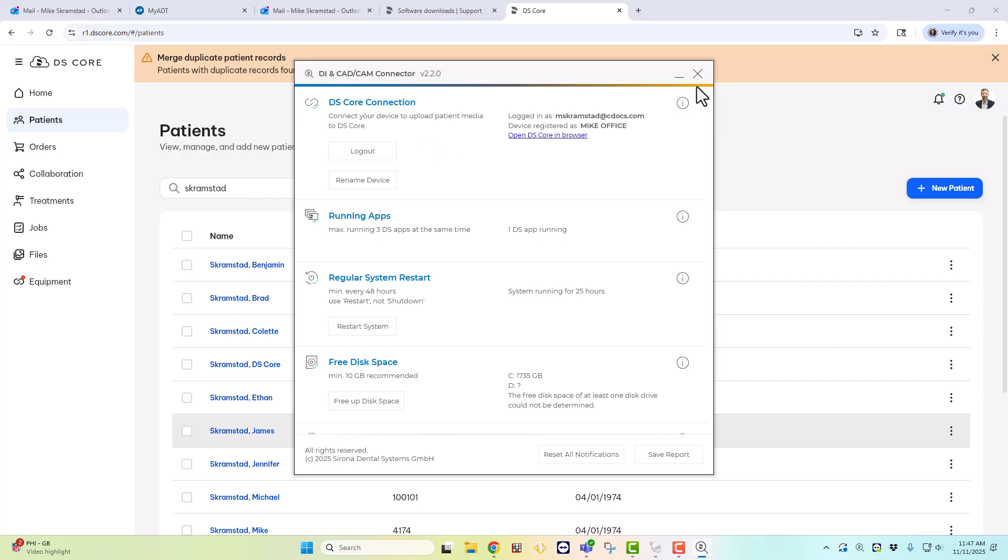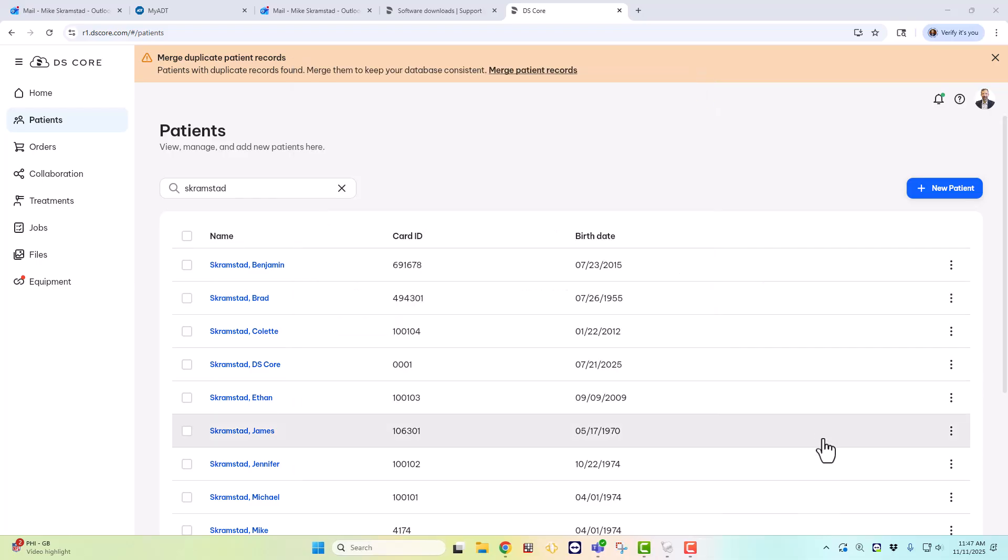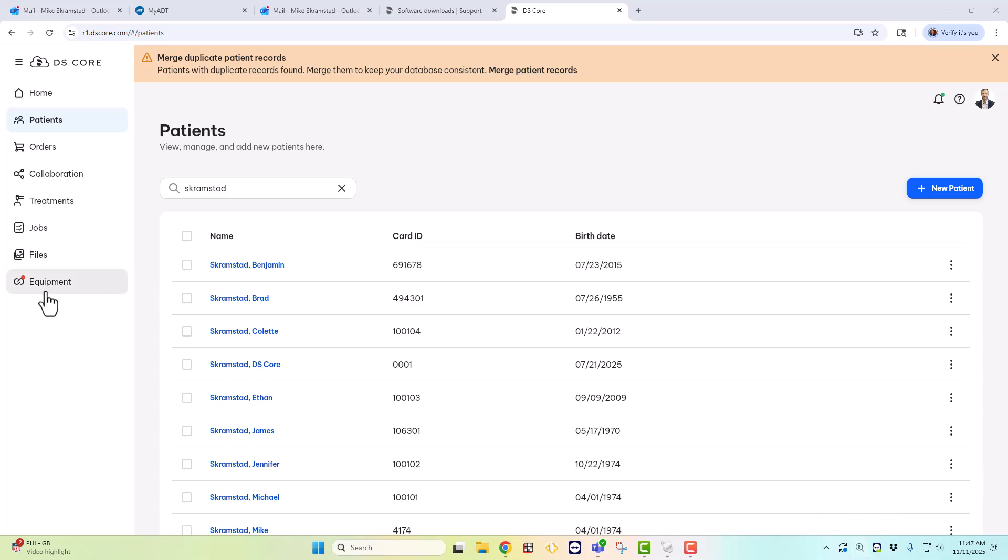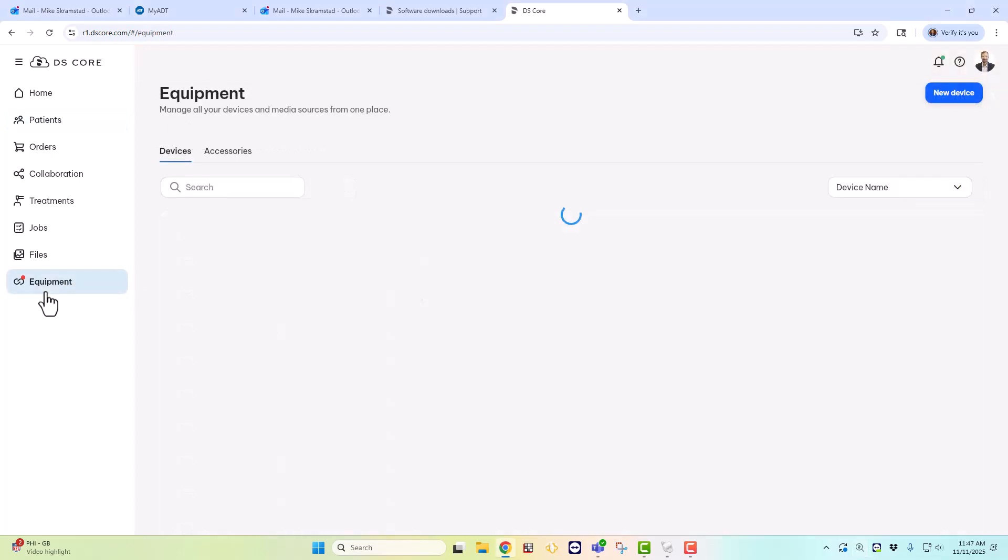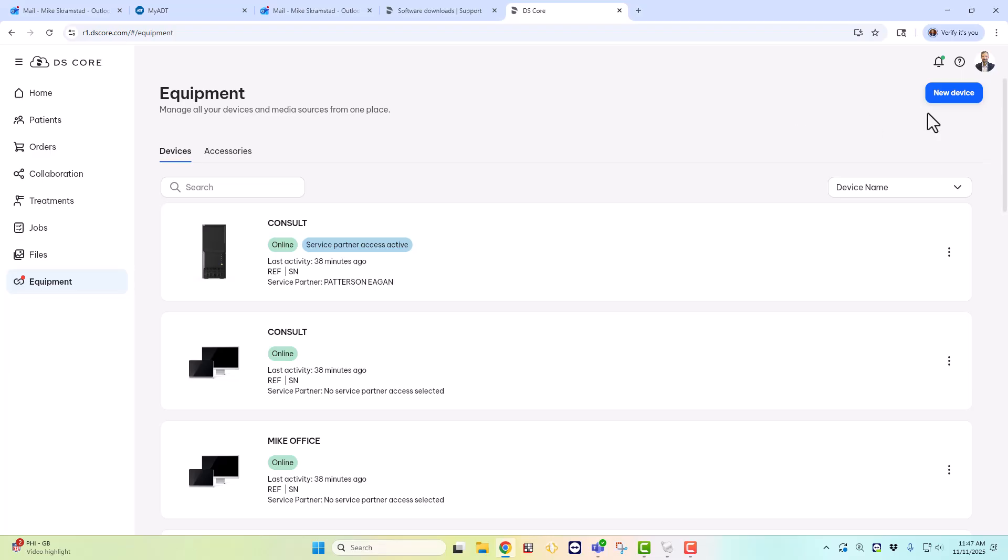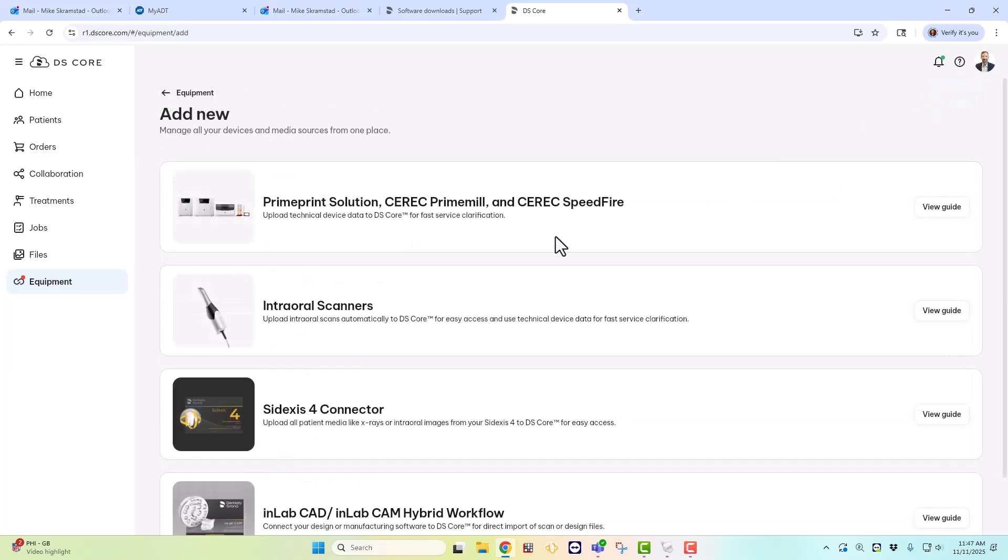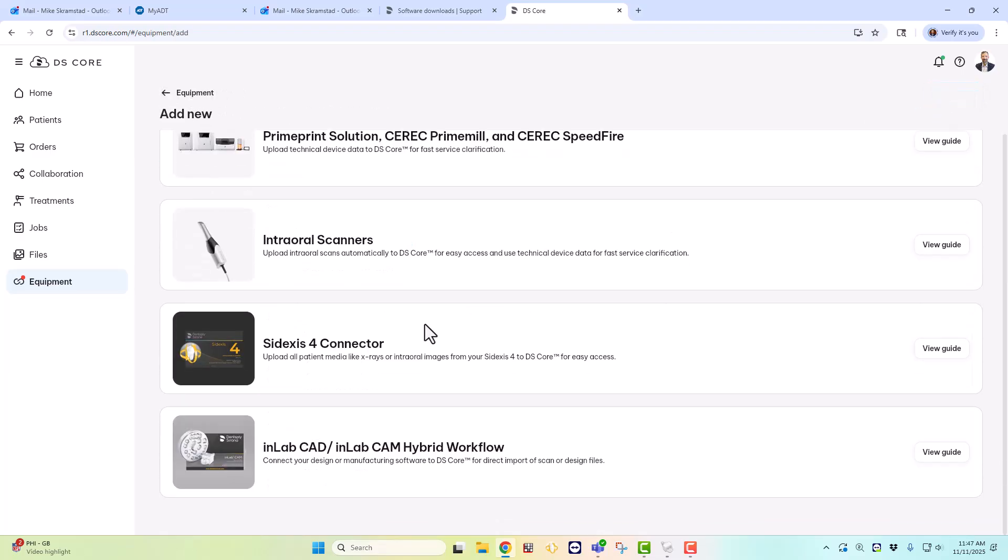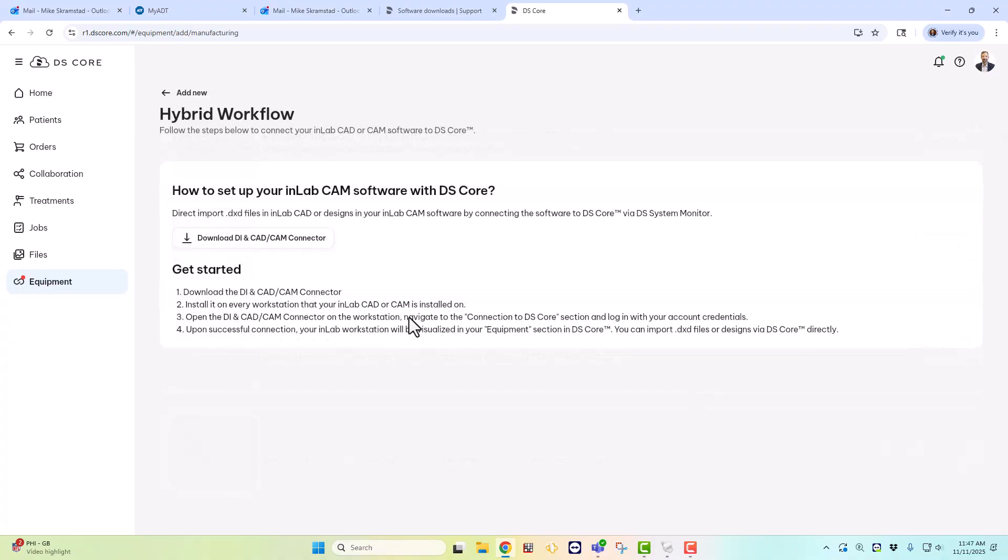Now if you don't see this little magnifying glass down there in the lower right taskbar, you need to download the DI and CAD-CAM connector. An easy way to do that is go to Equipment on DS-Core, go to New Device on the upper right hand side, scroll down to the InLab CAD and InLab CAM hybrid workflow, click View Guide, and you can download the newest version of the CAD-CAM connector right there. So that is how you make sure your PrimeScan is connected to DS-Core and is going to transfer the images to DS-Core.